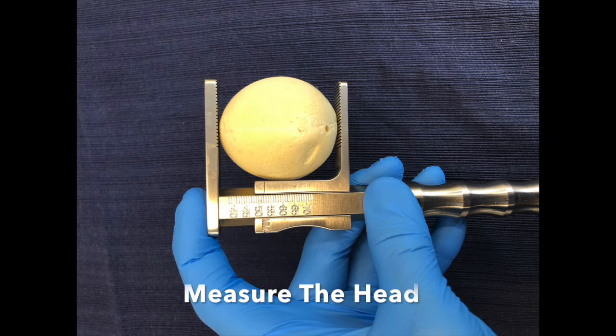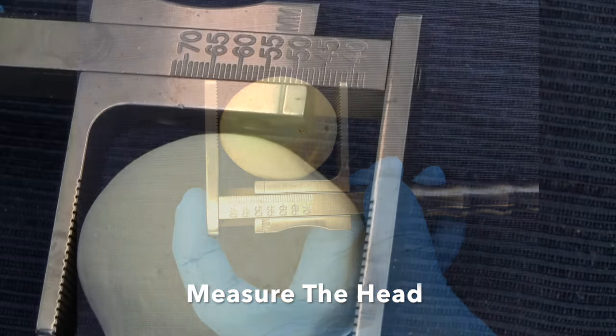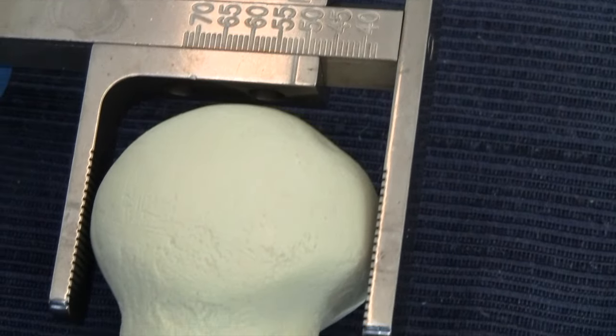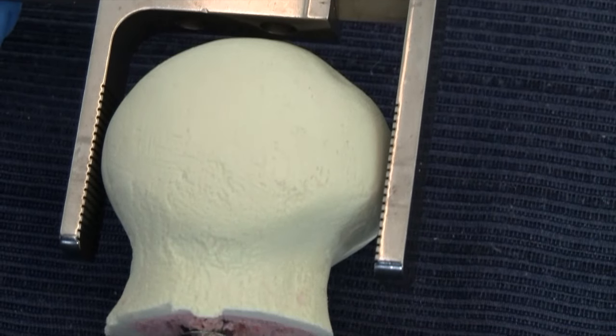Measure the femoral head as soon as practical. The size of the head not only tells you the acetabular trial size, but also gives you an indication of how big the stem might be.